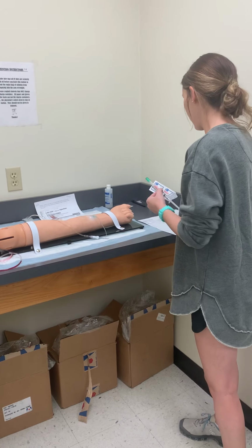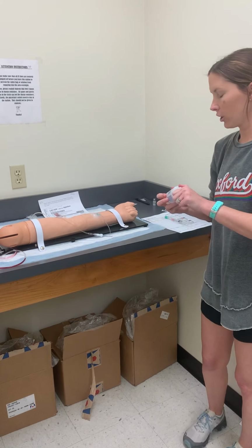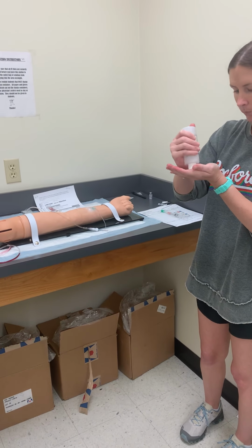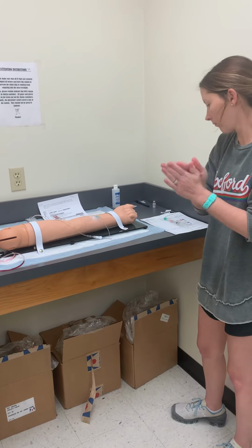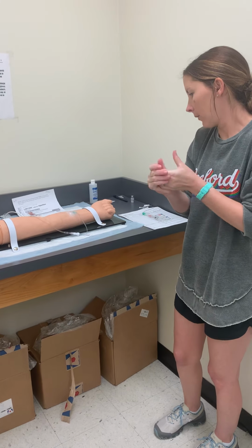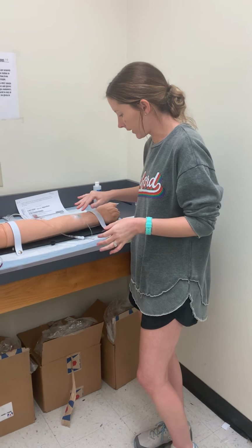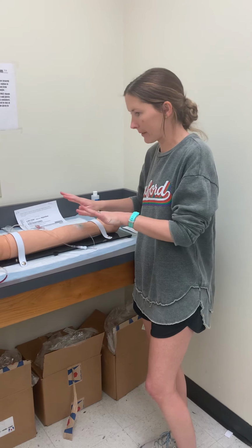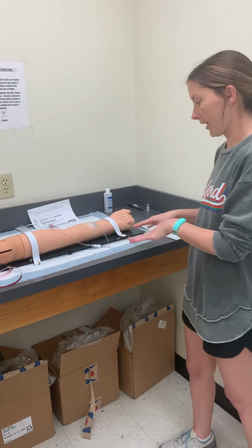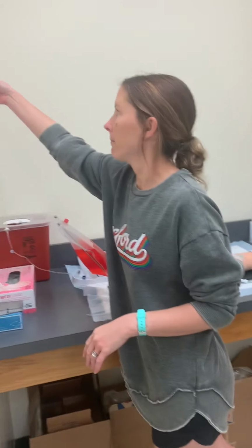Okay. I want to wash my hands before touching my patient. And now I want to check the arm. I want to check the IV site. I want to make sure there's no redness, no swelling, no leaking fluids, and ask them if they're having any pain around their IV site.